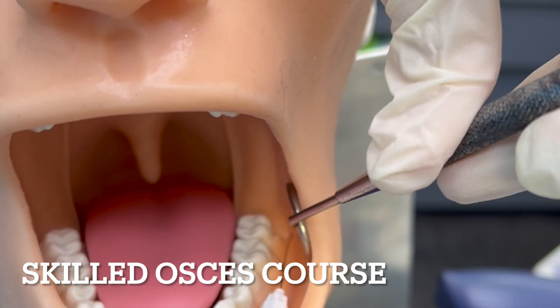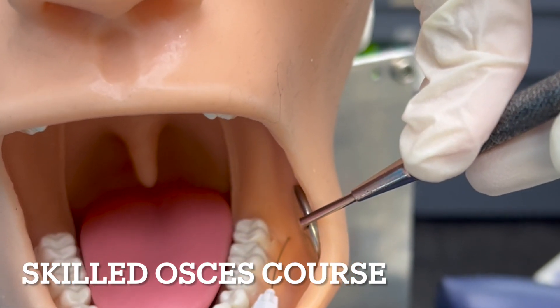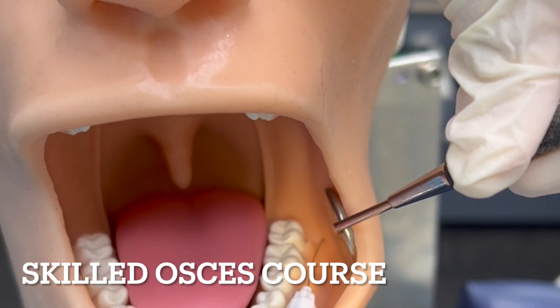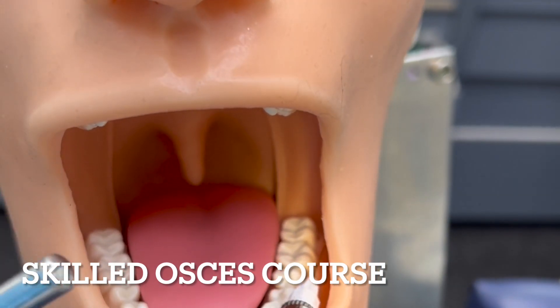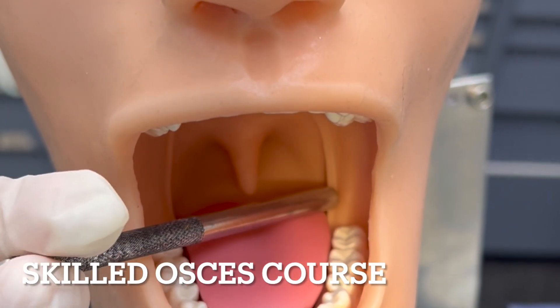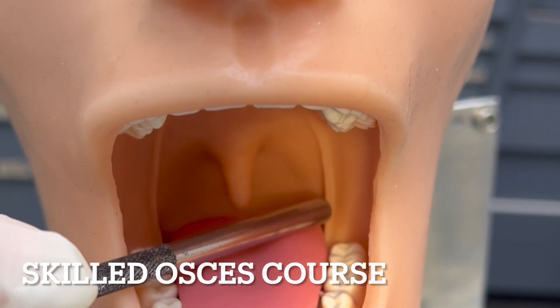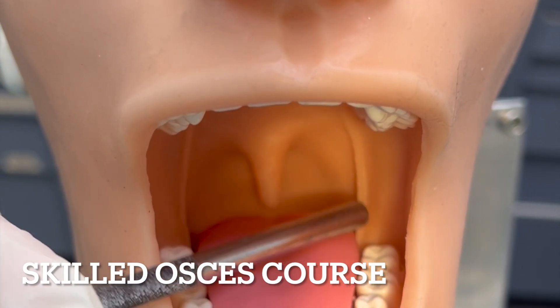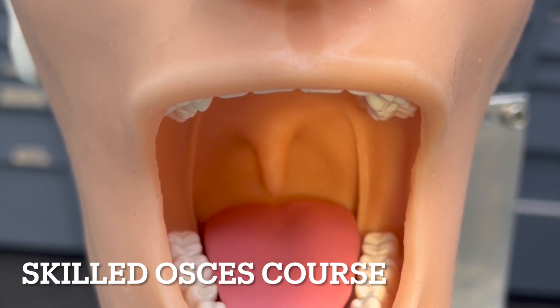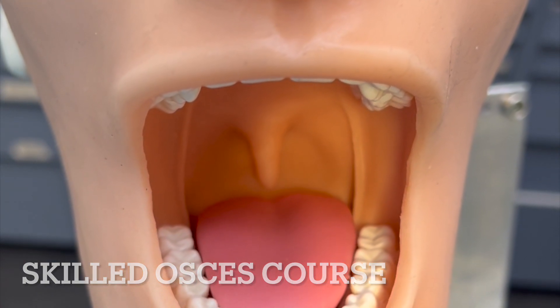That's for root canal, or when you have to use the rubber dam, or for extractions. You won't need to give a lingual nerve block, because that will be automatically anesthetized by the inferior alveolar nerve block. Thank you.